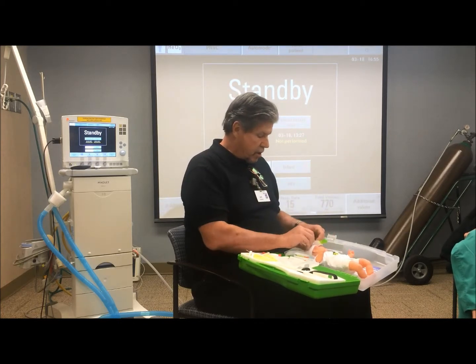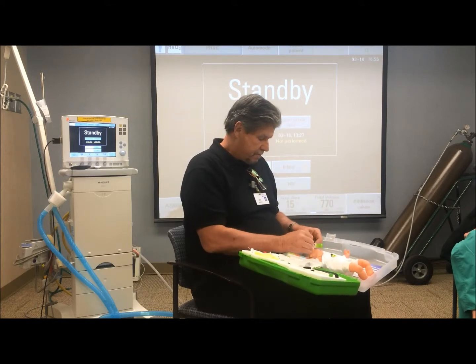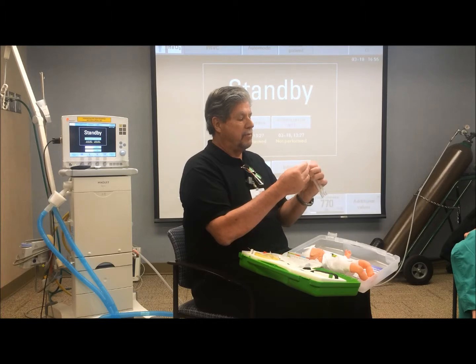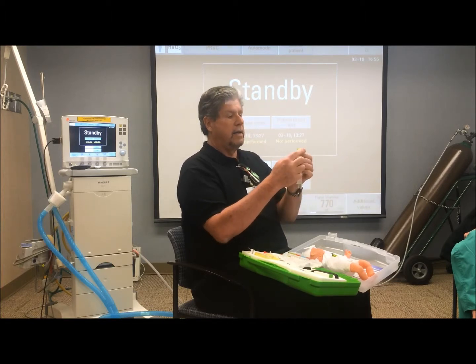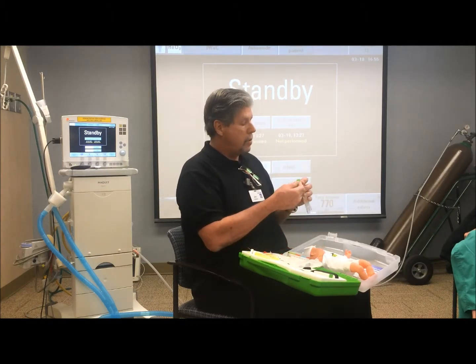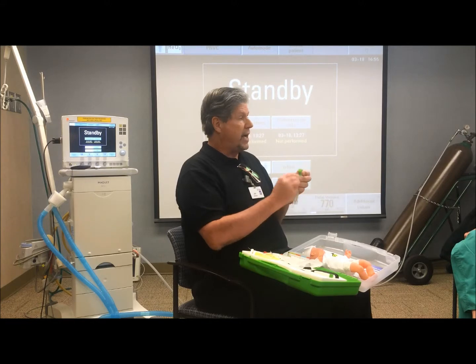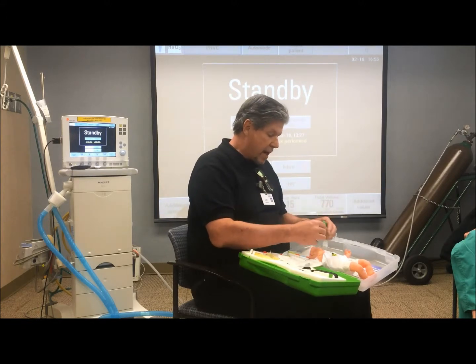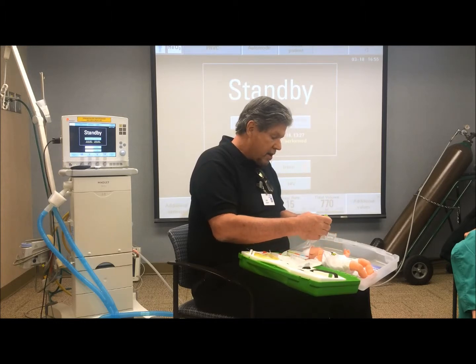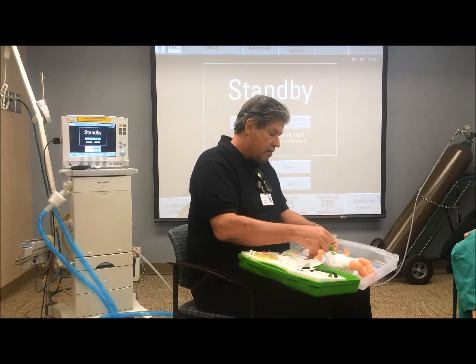So the way this works is these are hard plastic here, but what you'll end up doing is putting the prongs in like that, and now the prongs. So is that foolproof? Like you can only put it one way? Well, no, you could put it two ways, but this way, let me orient this right. You want to orient it so that the curved end is going towards the mouth. Right?